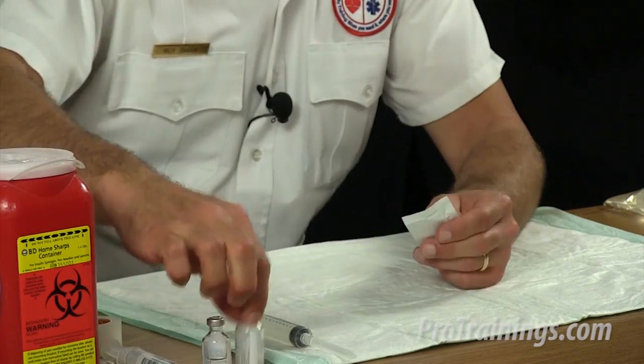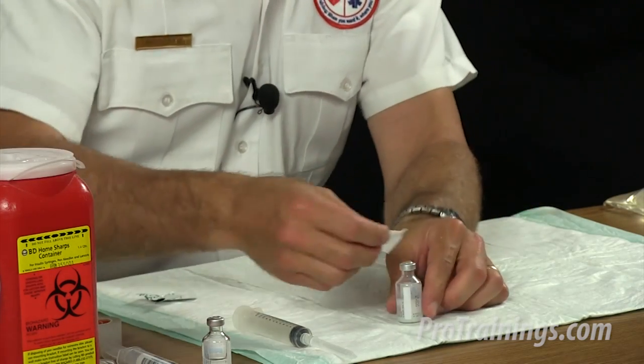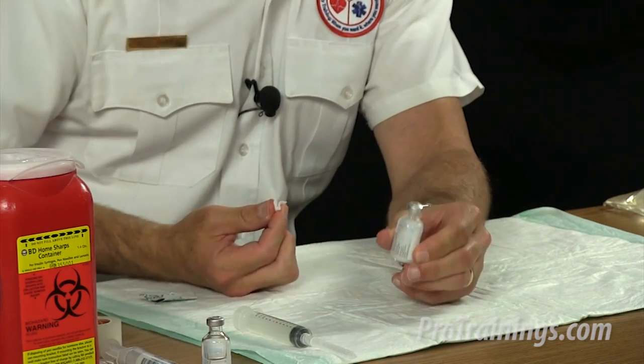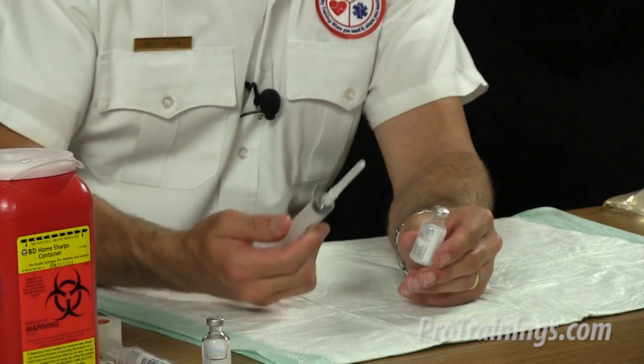Make sure to use aseptic technique to avoid contamination of sterile injection equipment. This means washing our hands, using clean gloves, using an alcohol wipe to clean any injection portals, vials, and skin where a needle will be inserted. So for example, in a real situation, maybe we have our gloves on after we've washed our hands. Depending on your local protocols, we can clean the top of that vial with the alcohol wipe before we actually draw up the medication.